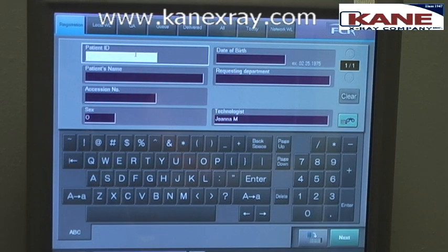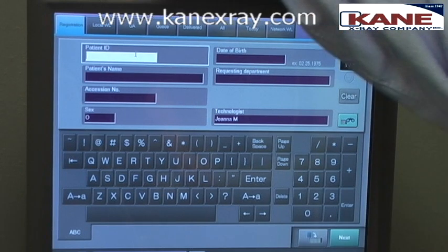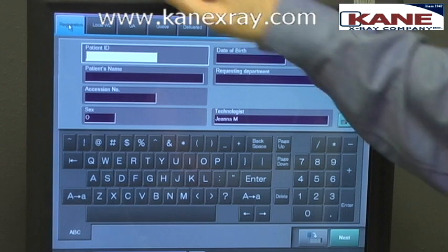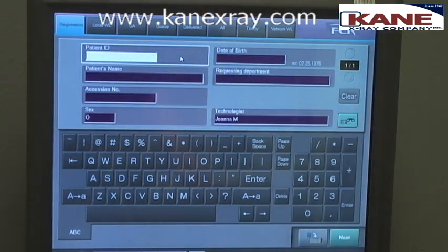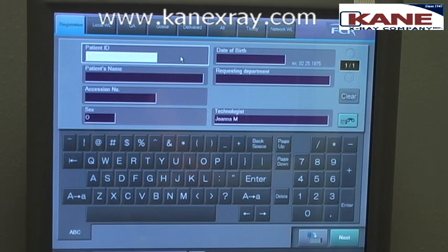To start a study with the Fuji system, we're first going to enter the patient demographics. On the main screen, in the registration window, we want to first enter our patient ID, which is a unique ID for just that patient or that pet — not the client name or number, but just the patient. That number is usually generated by the EMR or practice management software.